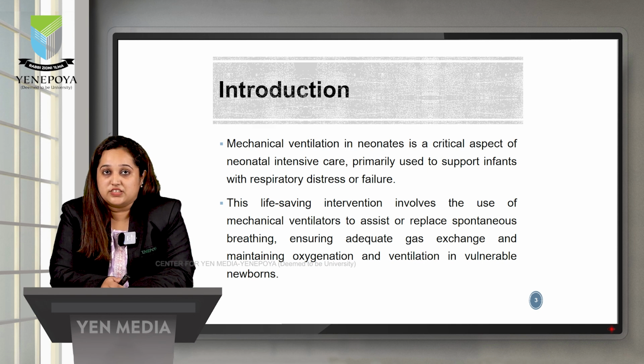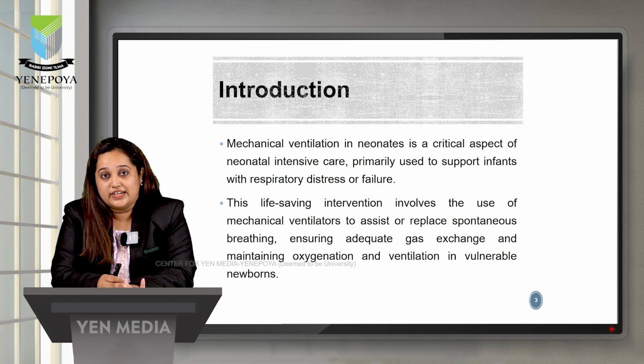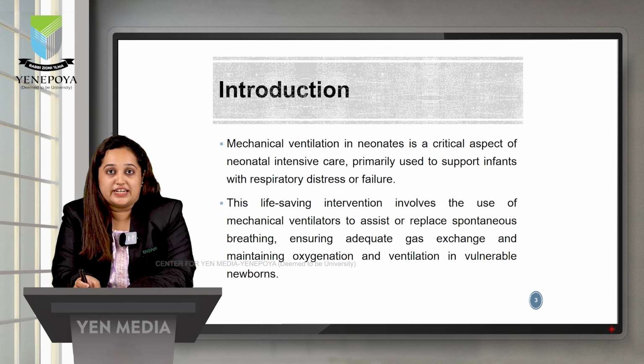This life-saving intervention involves the use of mechanical ventilators to assist or replace spontaneous breathing, ensuring adequate gas exchange and maintaining oxygenation and ventilation in vulnerable newborns. Whenever I say mechanically ventilating a neonate, it is about how we understand the aspects of oxygenating, ventilating and then also making sure that we prevent any kind of lung injury that can happen to that neonate. So when we talk about ventilating a neonate, it is more like lung protective ventilation that we follow.